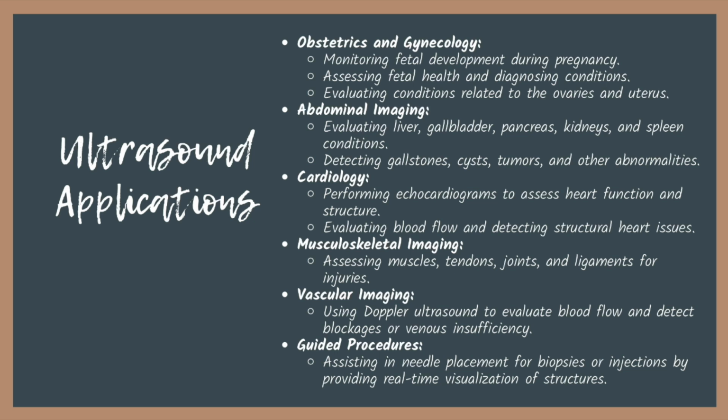So let's talk about the various applications of using ultrasound because there are many. Like I said, it's used in obstetrics and gynecology. It can monitor fetal development during pregnancy, assessing fetal health and diagnosing any conditions that are present, if any. It's also used for evaluating conditions related to the ovaries and uterus. It is again used for abdominal imaging, so we can evaluate the liver, gallbladder, pancreas, kidneys, spleen, appendix. Ultrasound can detect gallstones, cysts, tumors, and other abnormalities.